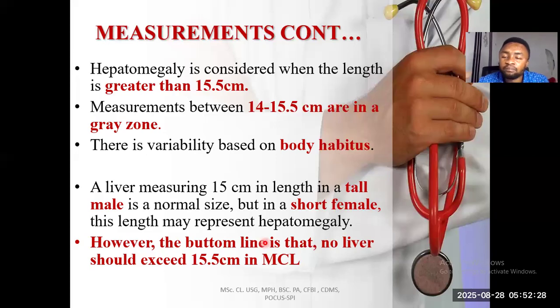Do you understand? But you see, ultrasound, we don't use it to confirm cancer. You can use it just to suggest it. The confirmation is what you have to go and do what? Histopathology. That is biopsy. You have to take some of the tissues from the organ and send it to the histopathologist. He is going to view them under the microscope and tell us that this is cancer. Ultrasound will see the features of the cancer, but ultrasound doesn't confirm. Do you understand? And we will talk about those things. Okay.